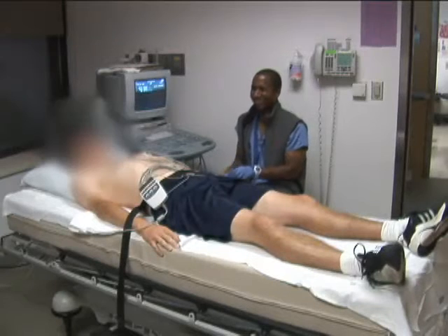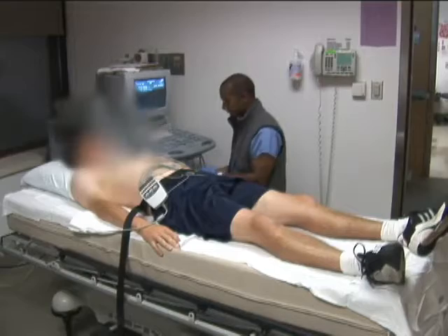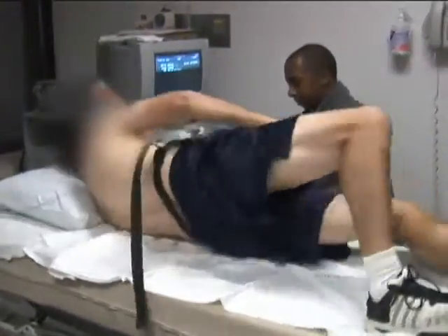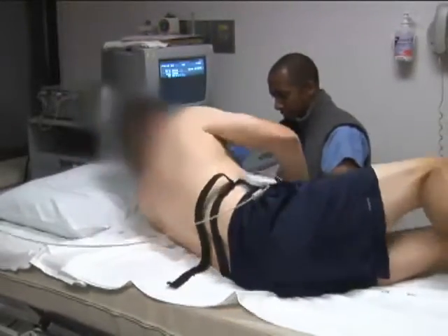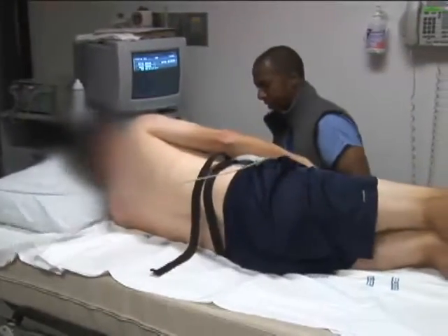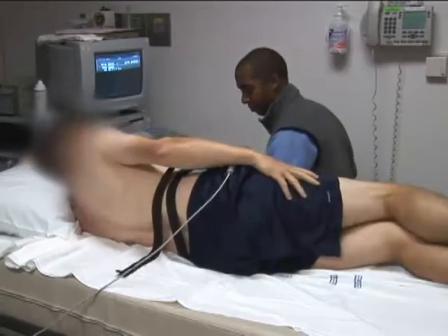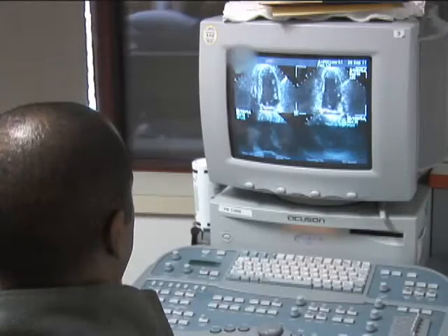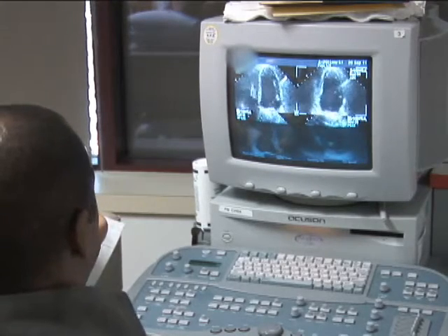The patient is positioned on the echo imaging bed in a left lateral decubitus position, and optimal ultrasound windows are marked lightly on the patient. Marks are used so that the same imaging window is used for comparison purposes at each stage. An adequate ECG signal is essential to ensure correct triggering of the digital cine loop acquisition. Several digital loops from each view are recorded. From these loops, the images that best show the left ventricular endocardial motion are saved.